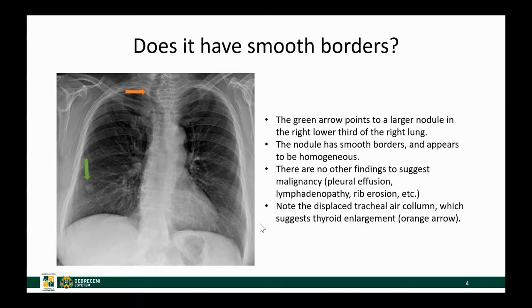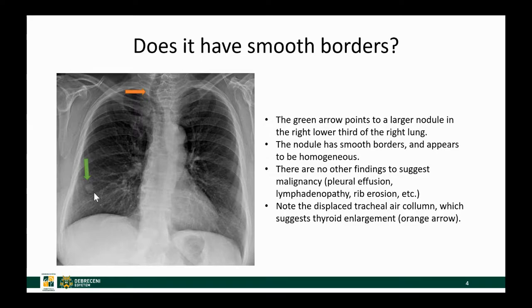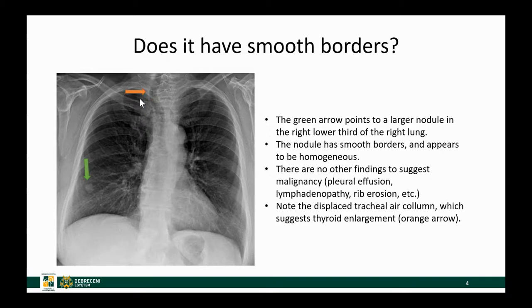With x-ray we can report on the borders of a nodule. Here you can see a nodule about 1.5 cm in the lower third of the right lung that appears quite homogeneous with smooth borders — so based on this image I would say this is a benign nodule, and I would either look for priors or recommend a chest CT. Also visible in this image is that the tracheal air column is dislocated to the right — not compressed, only dislocated — which is the typical appearance of an enlarged thyroid gland, something CT can also further characterize.